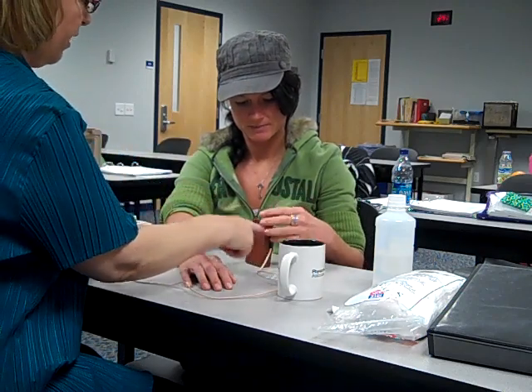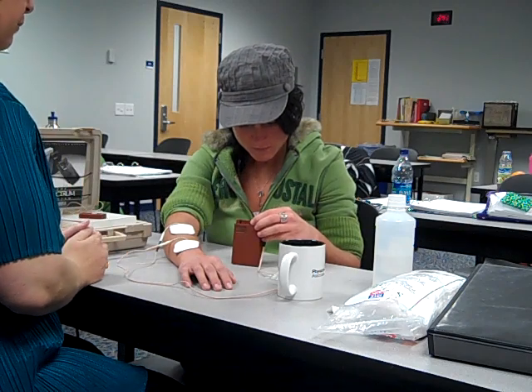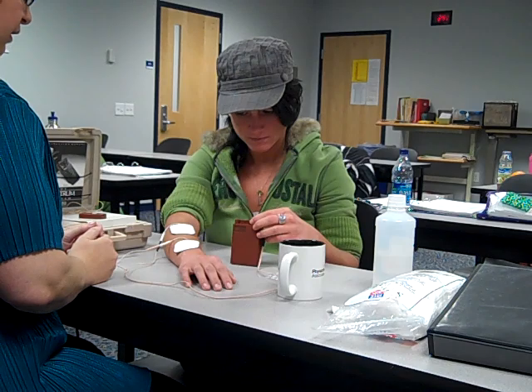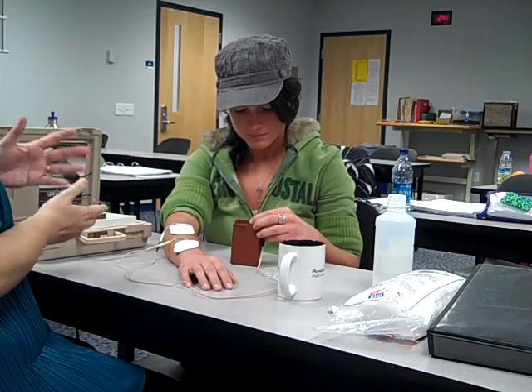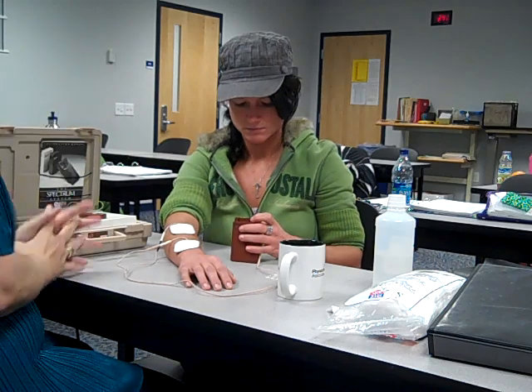So I'm turning it up this way. I'll look at it and see the numbers. Turn it up really slow. What I can find out from the patient is I can ask: is it a small sensation, medium, or large? And I kind of know where we are. So right now would you say it's small, medium, or large sensation? Small. Okay, so keep turning it up. Let me know when it gets to medium. I say medium.